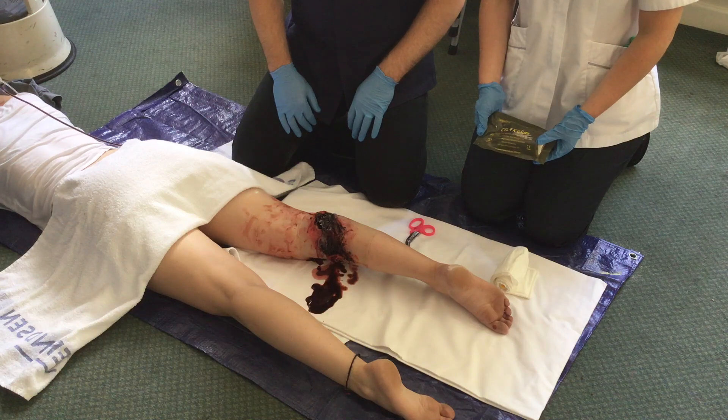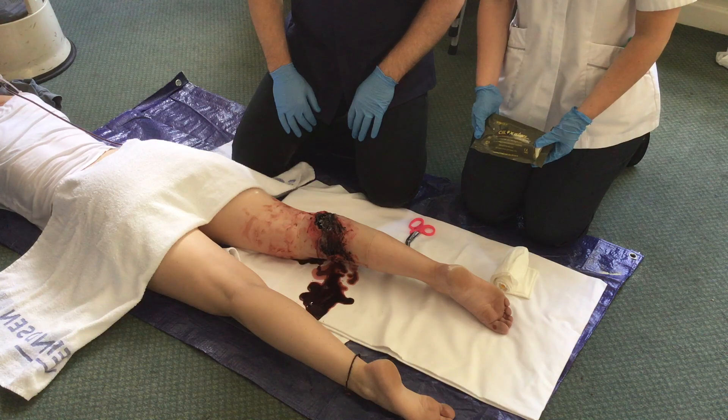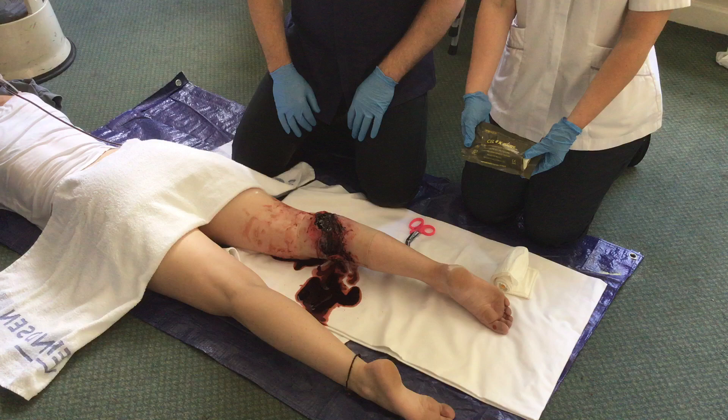Here we see an actively hemorrhaging lower limb soft tissue wound. A decision has been made to fill the wound with CELOX gauze in order to aid haemostasis.